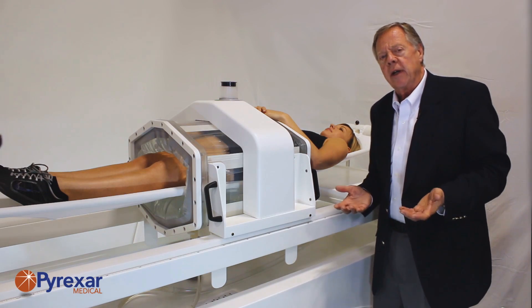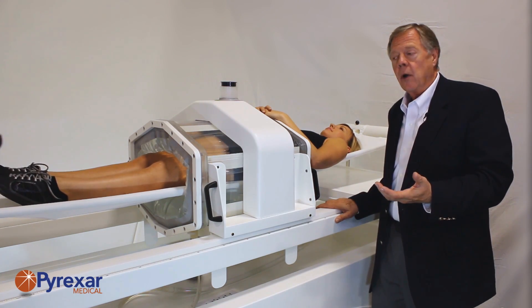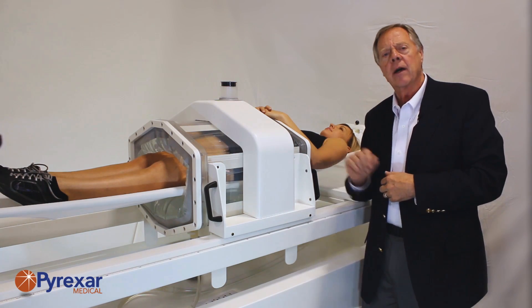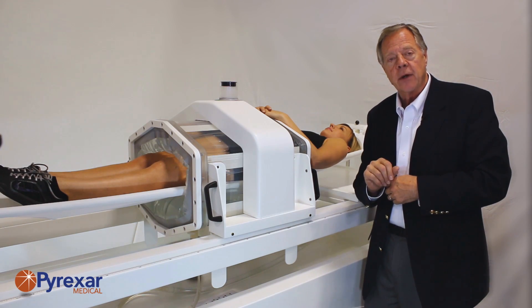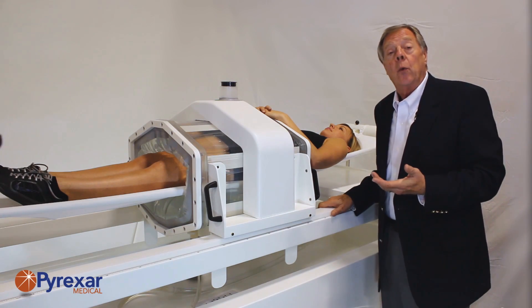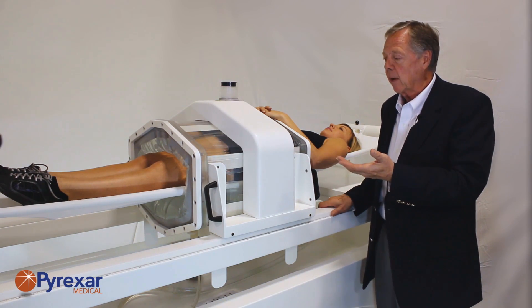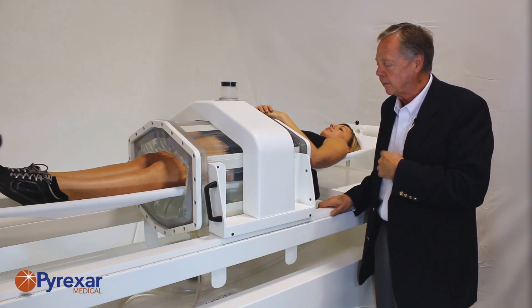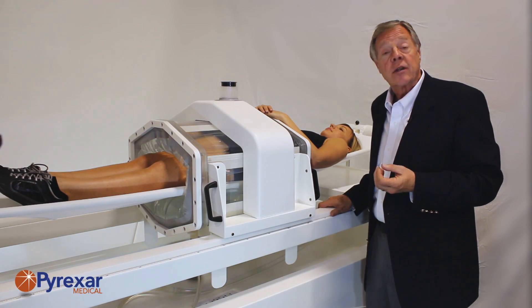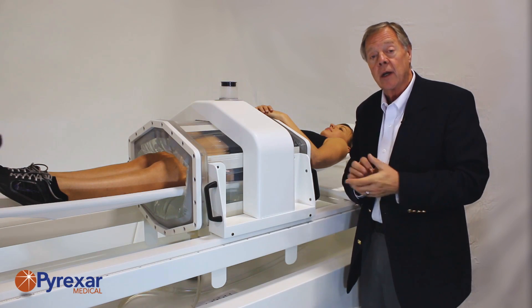The software incorporated in the BSD2000 phased array system allows for easy interface between the operator and the system. We've developed representations of the patient's body showing where the tumor would be located, so the operator can simply place a graphic icon to target the phase to a specific point in the patient's body — making it automatic and easy to direct energy to the point of interest. The system automatically controls the level of RF power once the target temperature is reached, acting like a thermostat feeding back to the computer. There is also a pre-treatment planning software program that allows modeling of the patient's body and planning of the optimal phase settings before treatment begins.